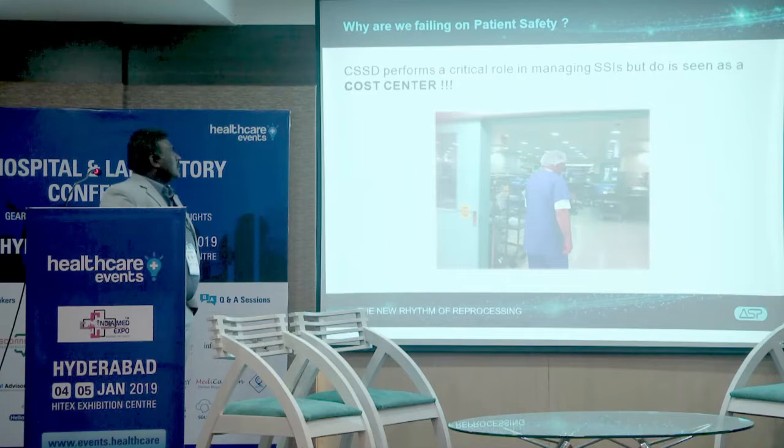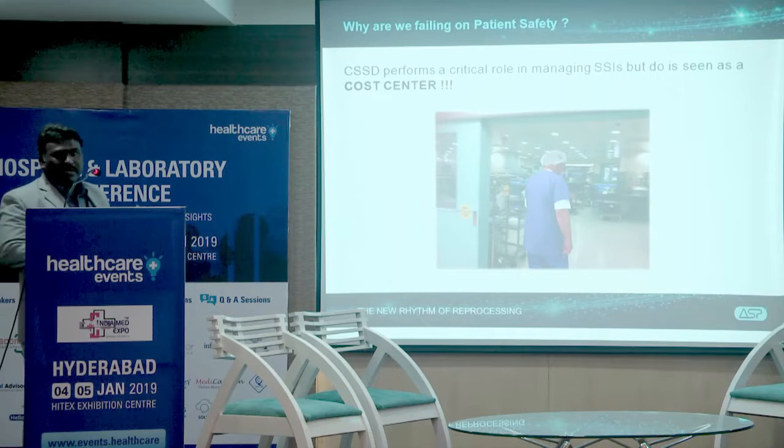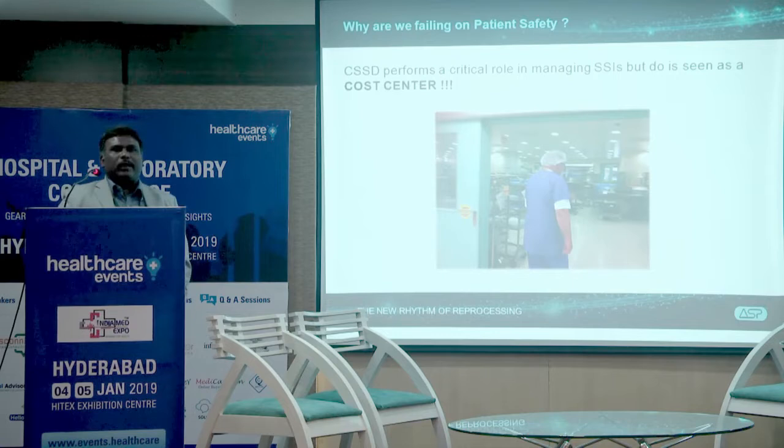So now, which department is taking the responsibility of the whole reprocessing? We all know that there is a department in each and every hospital, the Central Sterile Supply Department, known as CSSD. Unfortunately, today across the globe, this is commonly considered a cost center.